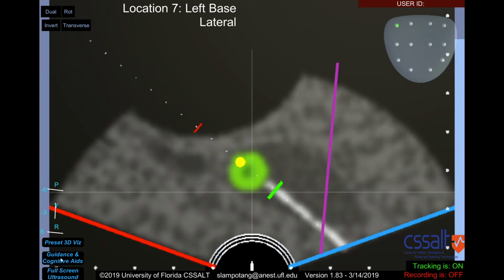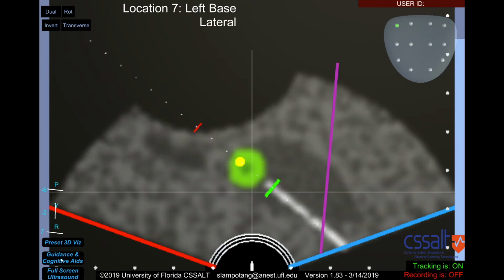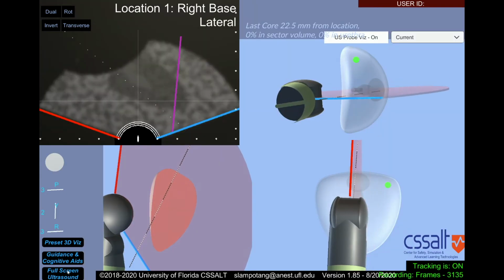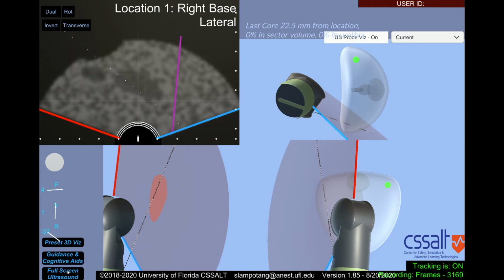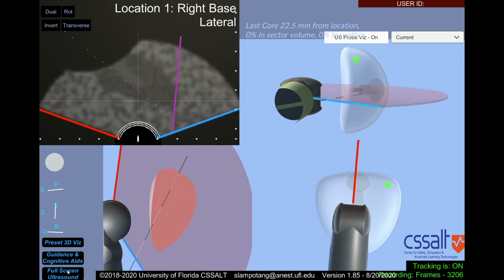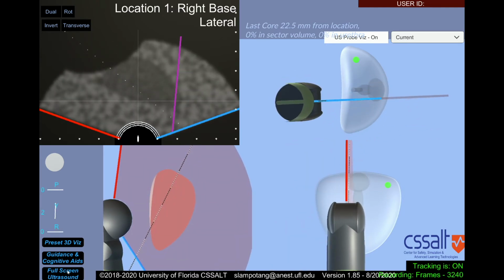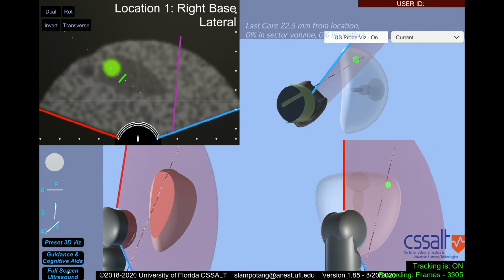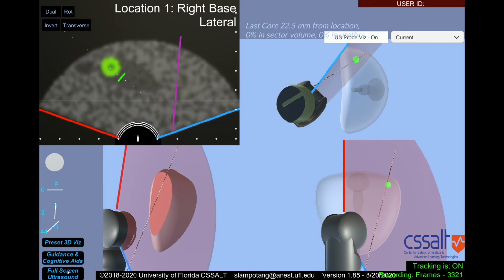The Visualization Mode button toggles the visibility of anatomical structures. One mode is ultrasound only, used to maximize clinical authenticity. The other mode is 3D visualization. It provides color images of the prostate, bladder, seminal vesicles, and patient position. The 3D visualization mode is useful for after-action reviews as well as introductory learning.